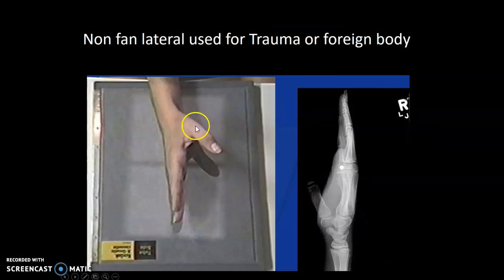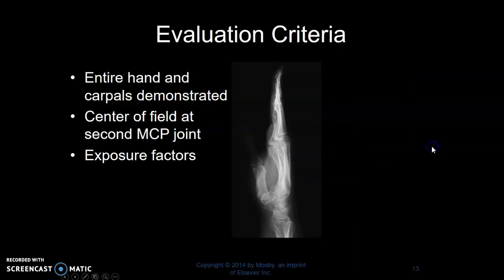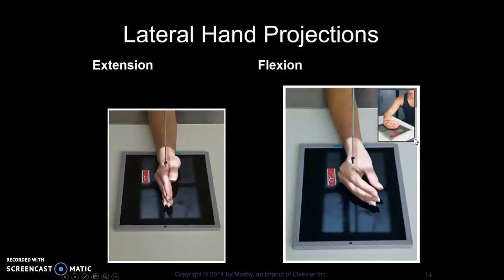This is a straight lateral, or some people call it a karate chop — hand out straight with thumb out. This may be used for trauma situations or if they're looking for a foreign body. You can see there's a BB in this patient's soft tissue. We only use that if we can't get a fan lateral. In your text, it identifies an extension and flexion version of hand laterals. We don't use this often at our clinical site, but that is in your textbook.